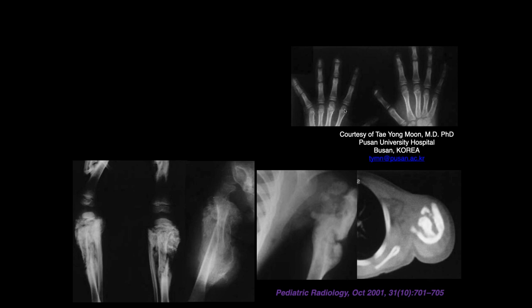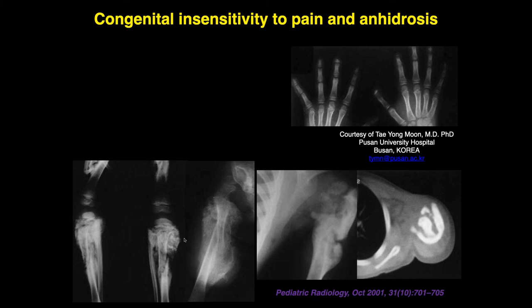Seeing it is huge periosteal reaction changes simply because they don't feel it, so they don't protect themselves. Exuberant callus. Okay.